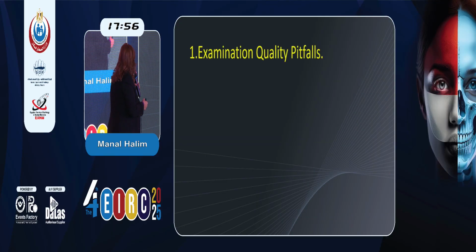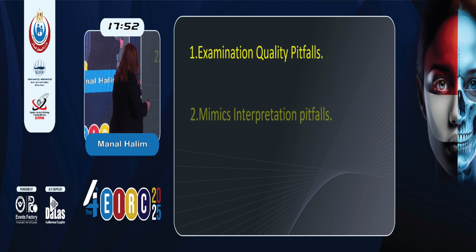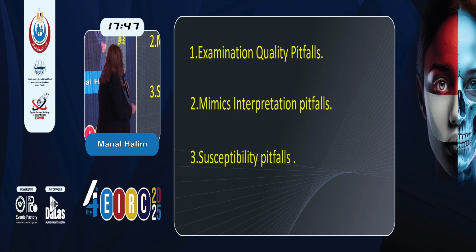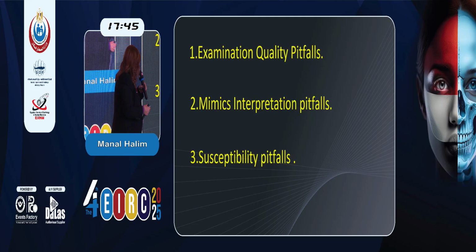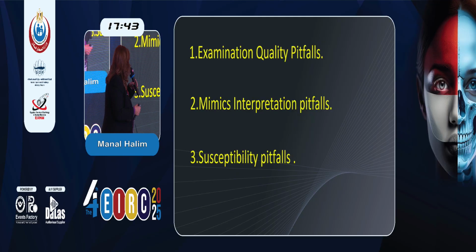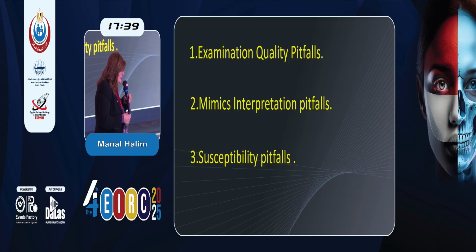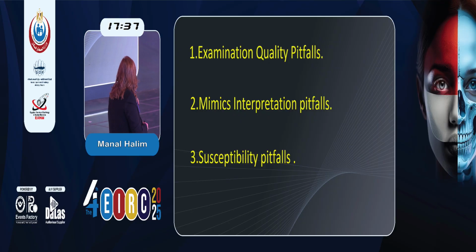And these pitfalls can be classified as: number one, examination quality pitfalls; number two, interpretation pitfalls or mimics; and number three, susceptibility pitfalls. To start with the examination quality pitfalls. This is one of the most important problems facing us in reading the MRI of the prostate.